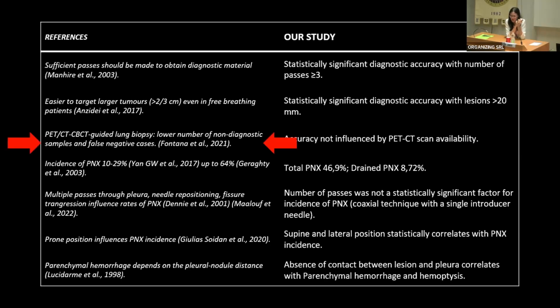As a radiologist, at the end, I would like to point out the importance of the use of PET-CT combined with CT images in a fusion technique. This allows us to find out where the most metabolically active parts of a mass are, so as to target this part, or in the setting of multiple nodules, to target the most metabolically active nodule.